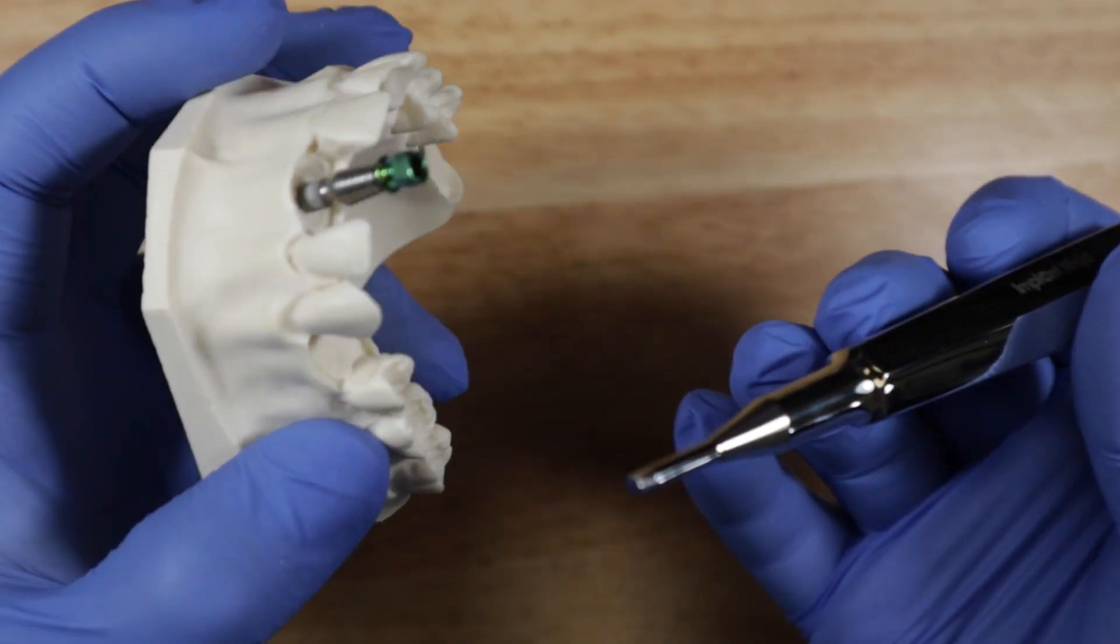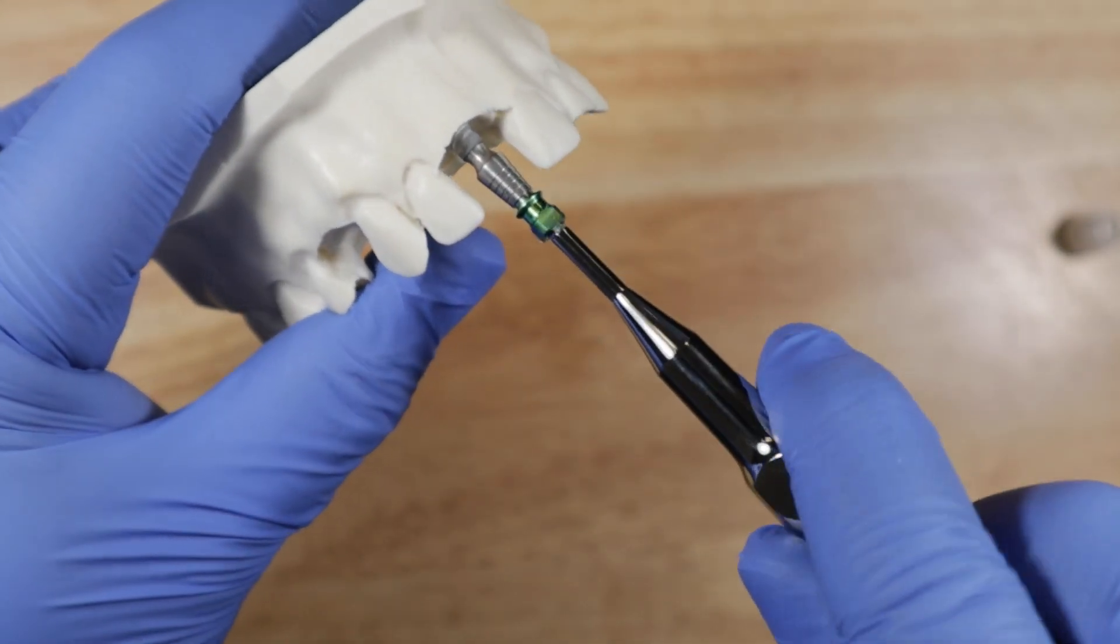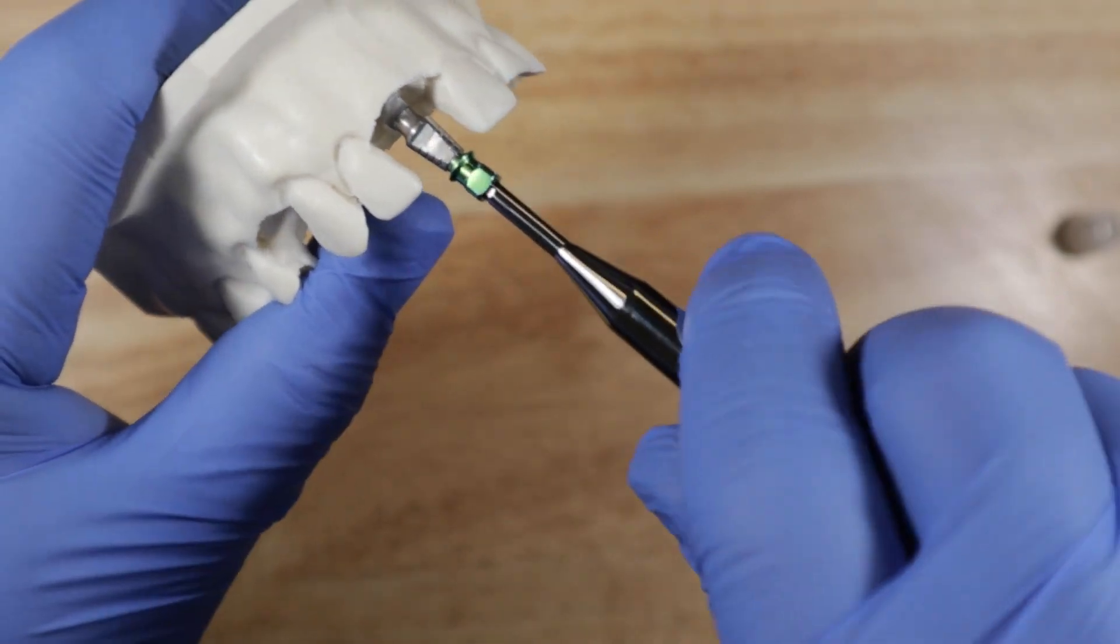So it's this convenient way to help you get the implant onto the site. So you already have the implant sort of where you want it. So then you're going to take this hand driver and you're going to stick it right there and use it to insert the implant in a more controlled fashion.